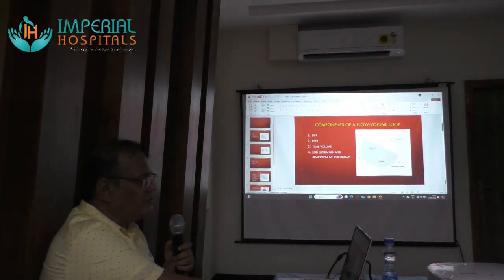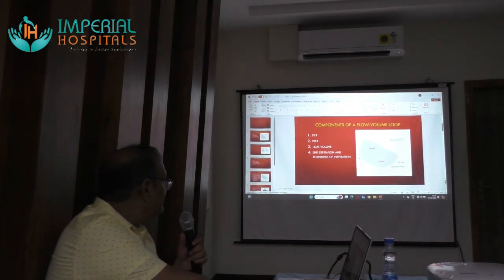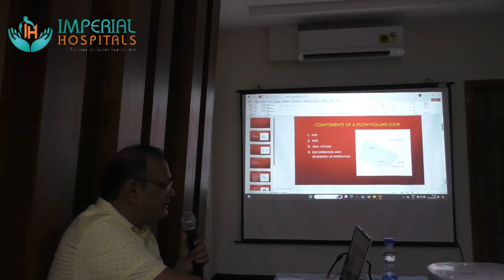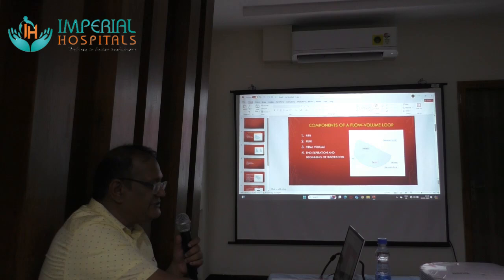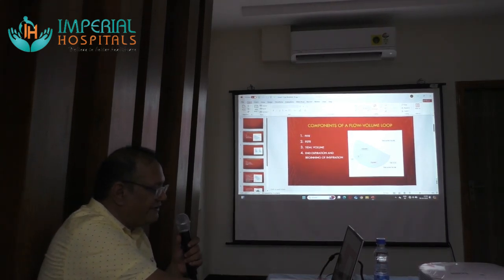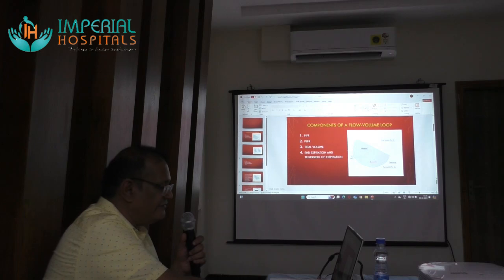The last loop we'll be discussing is the flow volume loop. In the flow volume loop, the things we can find out are peak inspiratory flow rate, peak expiratory flow rate, tidal volume, and we can identify where expiration ends and inspiration begins.